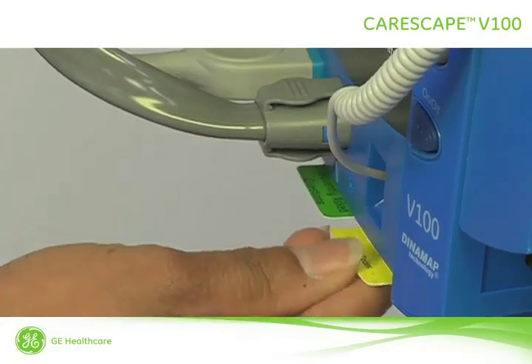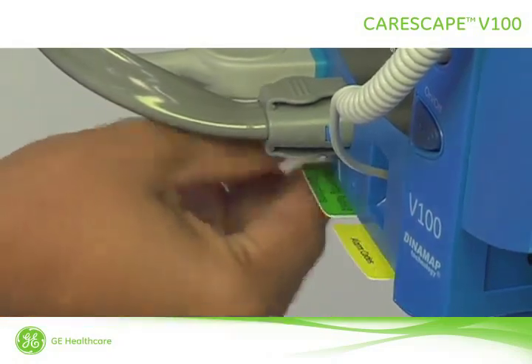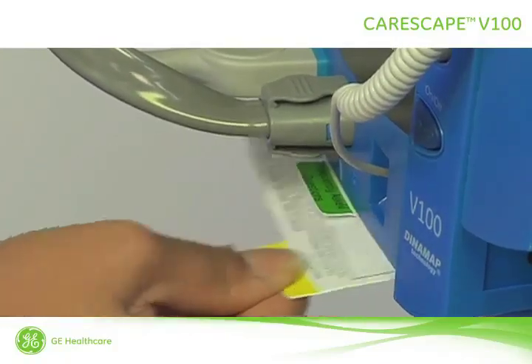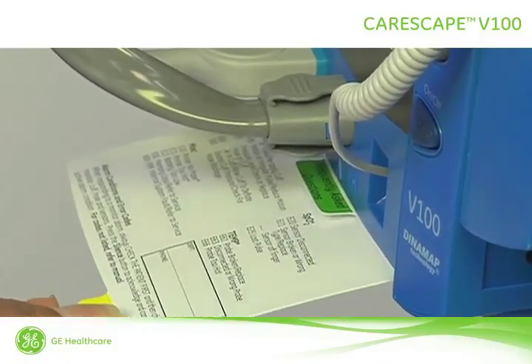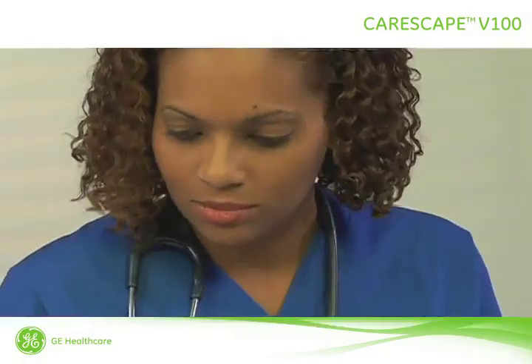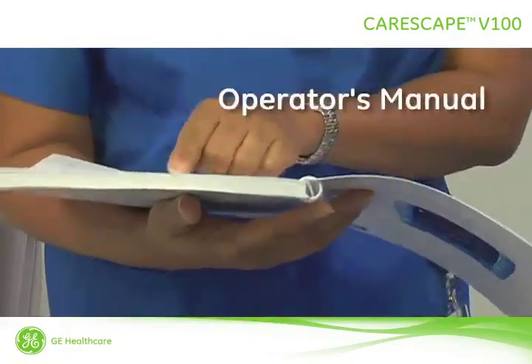Located at the bottom of the monitor are help cards that contain a quick reference guide. These cards are categorized as operation, frequently asked questions, and alarm codes. Additionally, there's a spot for you to write in the department, floor, or ward to which this vital signs monitor is assigned. For further in-depth information about the Carescape V100, please refer to the Operator's Manual.